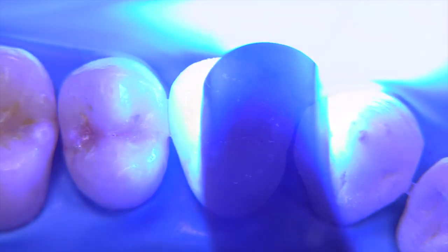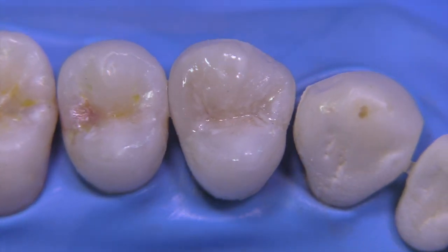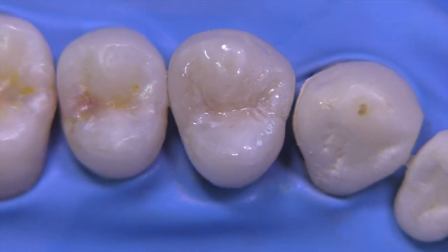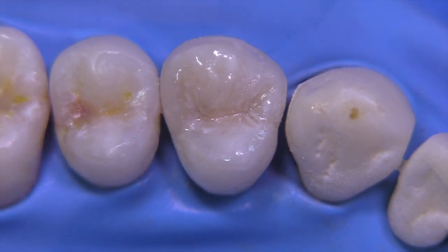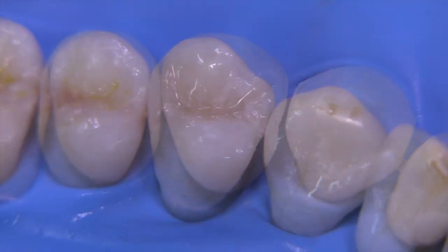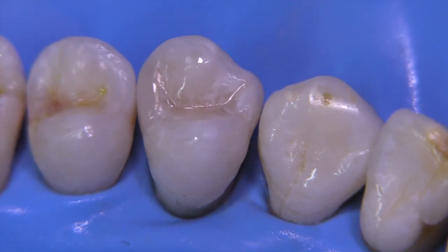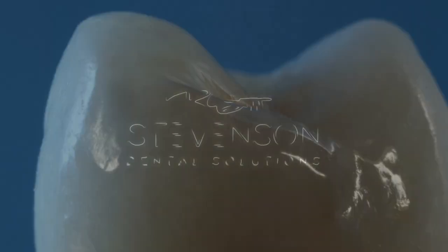By pre-contouring the restoration, you don't end up removing all of your final translucent layer, and you end up with a restoration that doesn't require a lot of occlusal adjustment or changes that might affect your final look. I think it turned out okay — it's certainly not a perfect match, but I like the opacity. I definitely want to thank you for spending time with me in this class two restoration. Lots more videos coming — make sure you give me feedback. Thank you.